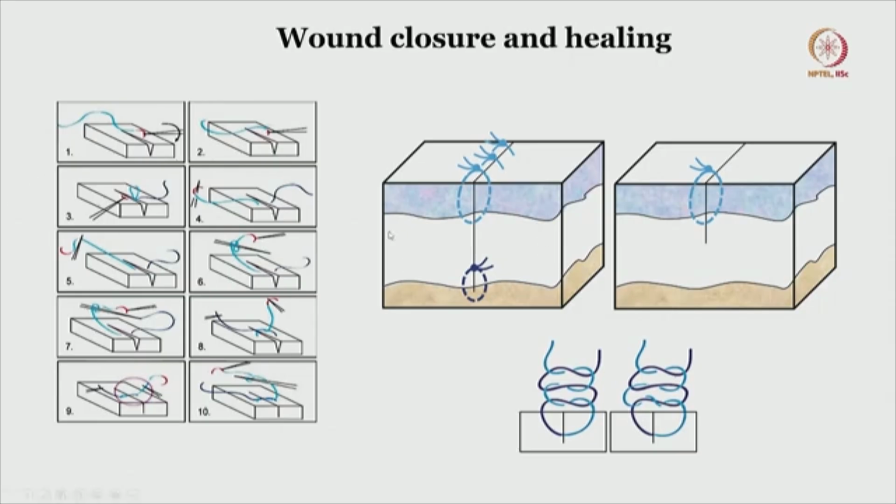So you can do the suturing in either 2 layers or 1 layer. For the rat model, generally 1 layer should suffice, because the scalp layer is just 1 layer, beneath which you have muscle only. For the temporal craniotomy, the temporalis muscle is usually excised, so you do not really have to suture it back, as we saw. But if it is the abdomen or the spine, then you will have to close in 2 layers, where the muscular layer forms 1 layer and then the skin comes on top of that.